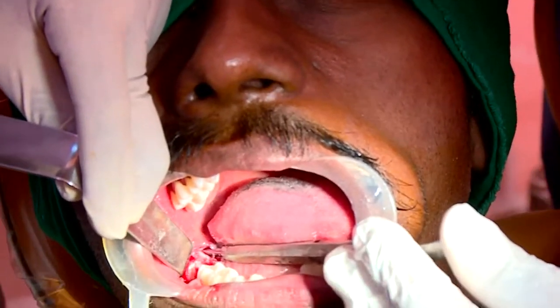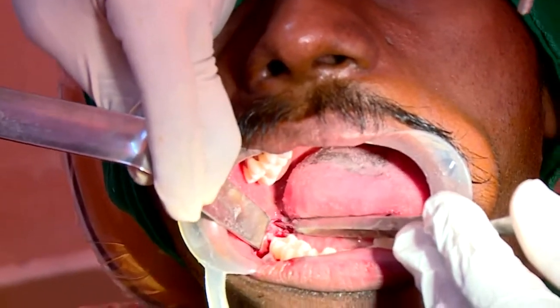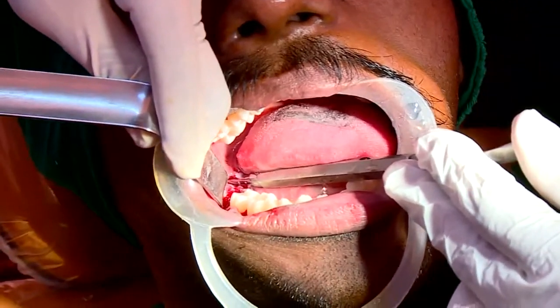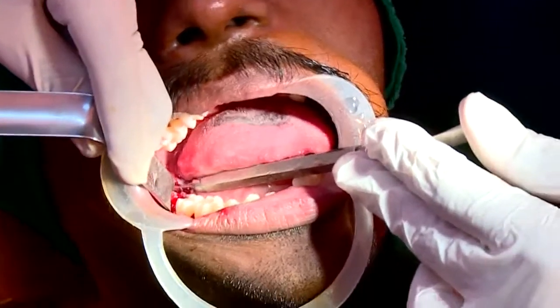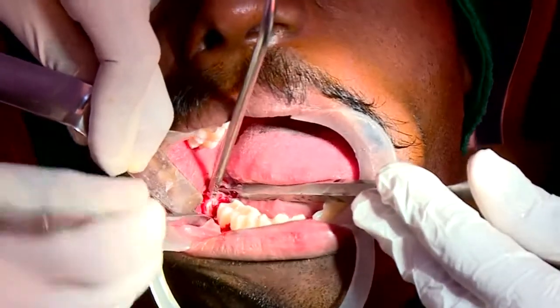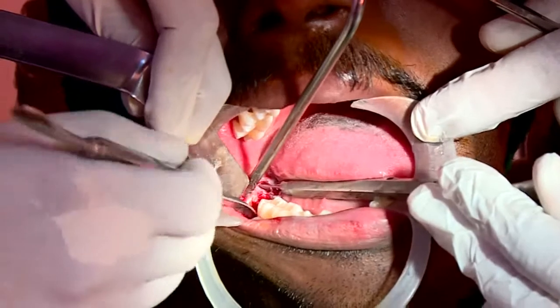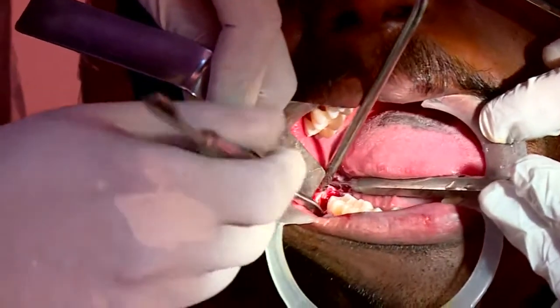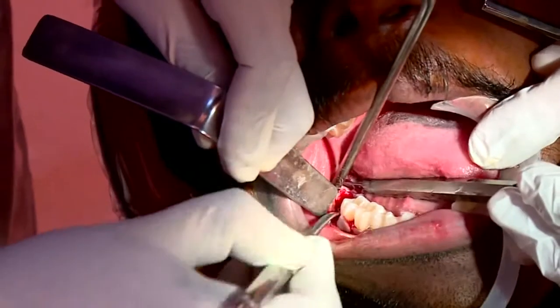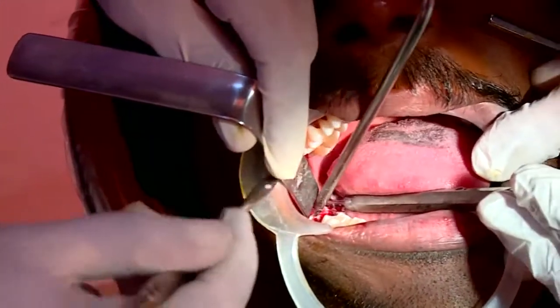What usually happens when we do this is that everything is slower, because now we are in the deeper portion. We cannot cut blindly and we cannot apply more force. More force can cause an unwanted fracture, but more importantly, you can damage the inferior alveolar nerve. So slowly, you have to only slowly cut and elevate the tooth.